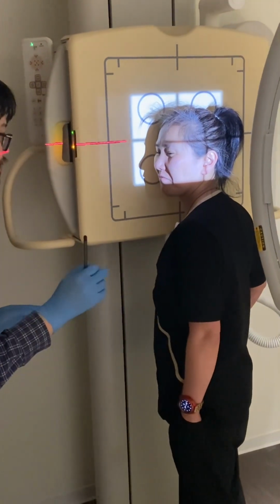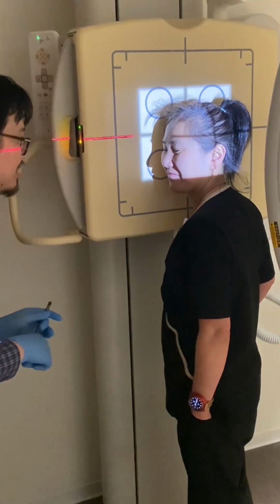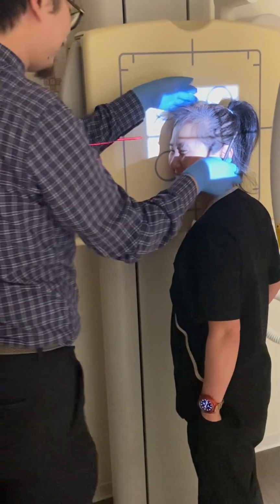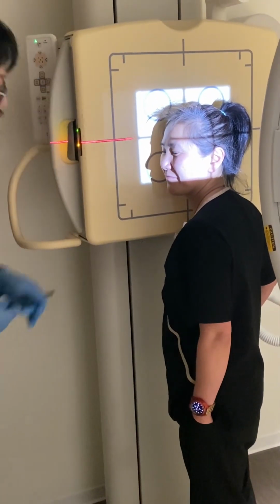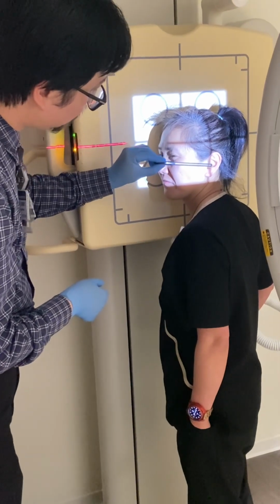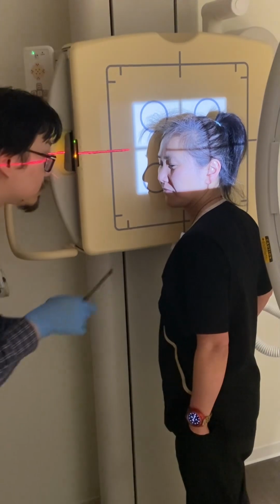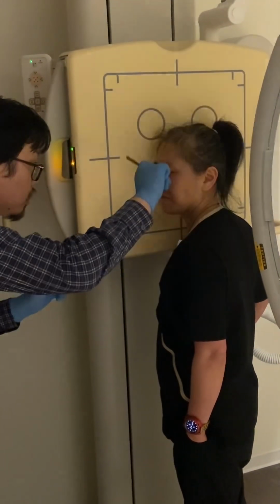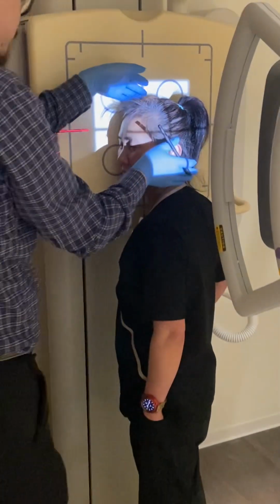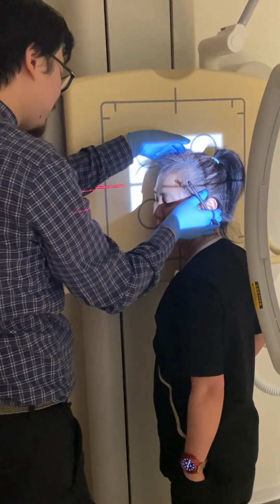All right. A little bit closer. So, top of the head just a tiny bit away, and then touch. Good. Now notice when I was doing that, IOML, lift it back up a tiny bit. So bring your chin down just a little bit. Good. All right, rotation. I see chin here, ear there. Looks pretty good. Our tilt is just very slightly off. I'm gonna take the top of your head, just move it away a little bit more. Chin down. Good. Touch.